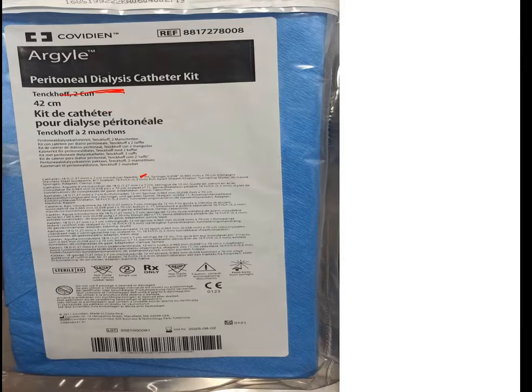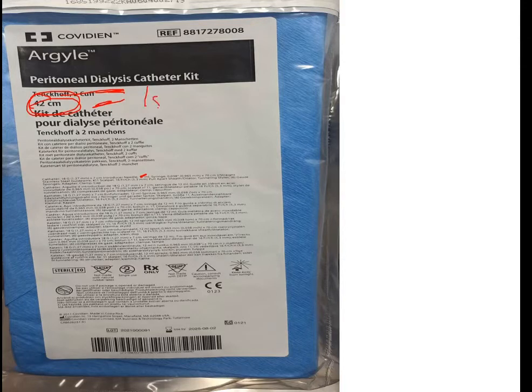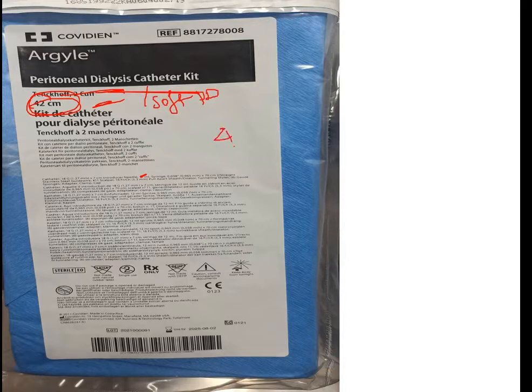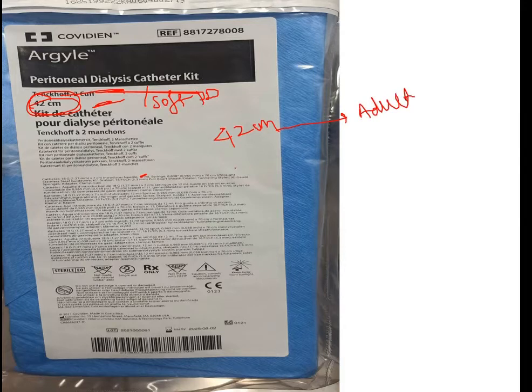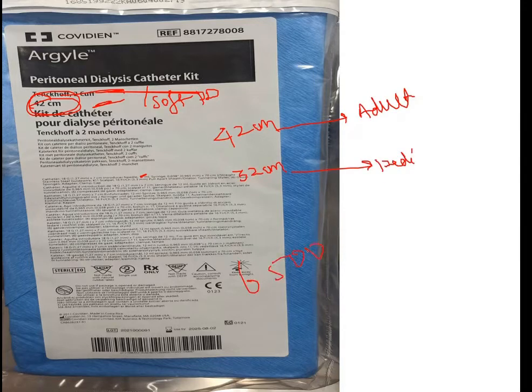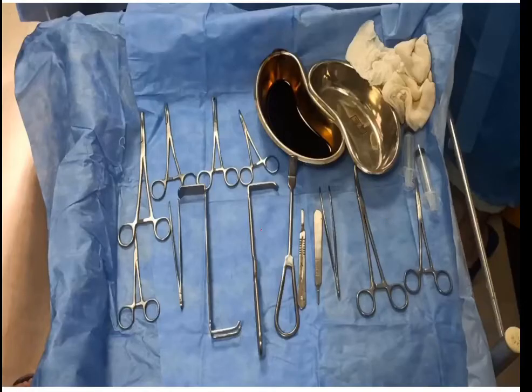This is the PD catheter set — the 42 centimeter Tenckhoff catheter. Tenckhoff soft PD catheters are available in two sizes: one is 42 centimeters, used for adults, and another is 32 centimeters, used for the pediatric population. The approximate cost of this in India is around six thousand to seven thousand rupees.